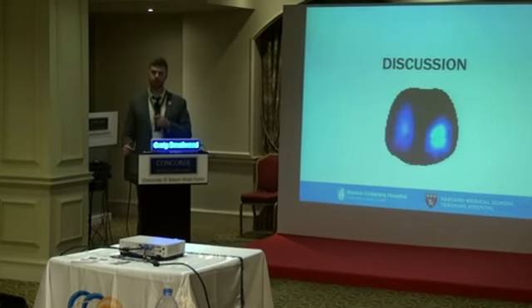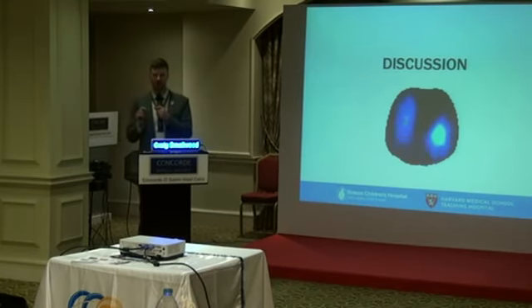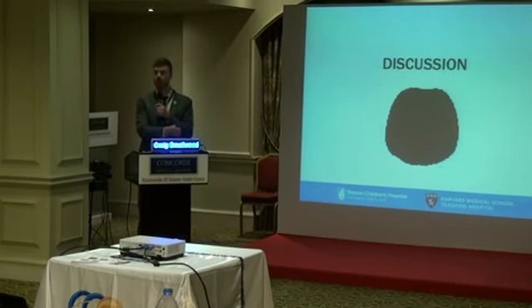But what about the change in functional residual capacity if you are monitoring the patient for a long period? Does the change in functional residual capacity reflect in the image or not? Yeah, so you're asking, basically, we don't have good absolute information about what the EIT device is telling us, but we can go day to day or even hour to hour and look at changes relative to some baseline in the past. And that's principally how the device is utilized, if that's your question.